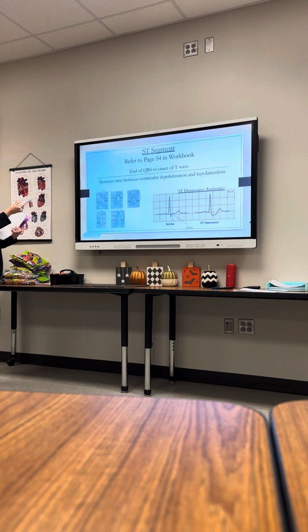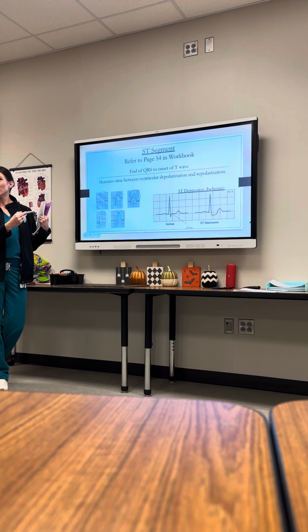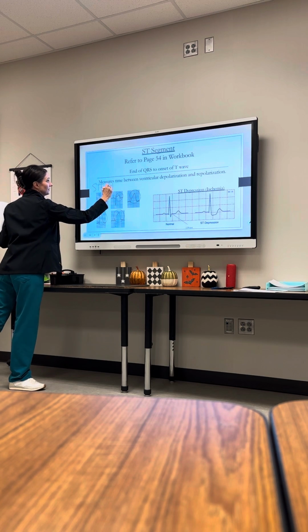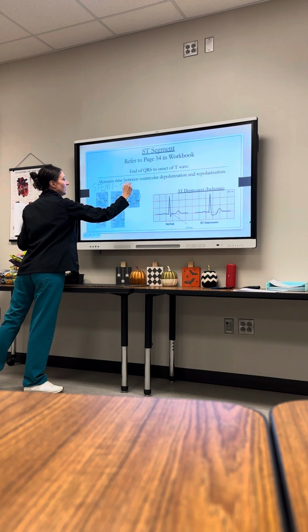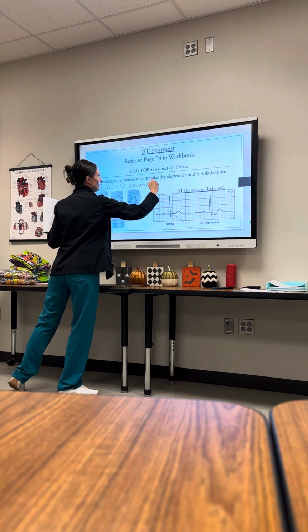And what it's telling me is that my patient is having a myocardial infarction. So we call this a STEMI. What do you think it stands for? ST elevated myocardial infarction.